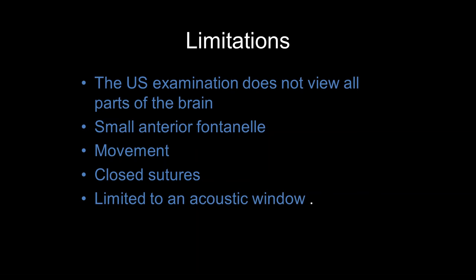Most of those infants just have a constitutionally enlarged head, and when you do the cranial ultrasound scan, what you just see is normal ventricles, no post-hemorrhagic hydrocephalus, no dilated ventricles, no big subarachnoid spaces. You just see a normal brain, and I think that it's a good screening tool. But obviously, if the infant continues to cross the centiles, you then want to go on and do further scanning. But as a primary investigation for infants with a large head that people are concerned about, I think that it's quite a valuable tool. Up to the time when the suture is closed and you can no longer get good windows, it's quite a reasonable tool, up to 3 months.